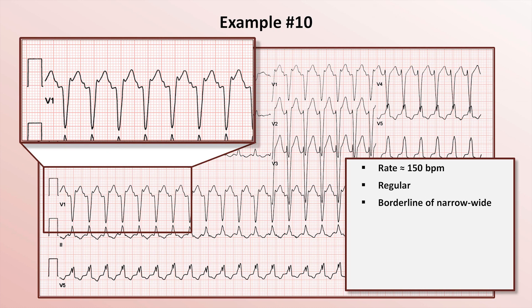Not only is there regular, consistent atrial activity at the tail end of each T-wave, there is also a tiny bump at the very beginning of the ST segment. If you assumed that this was part of the QRS complex, that's completely understandable.